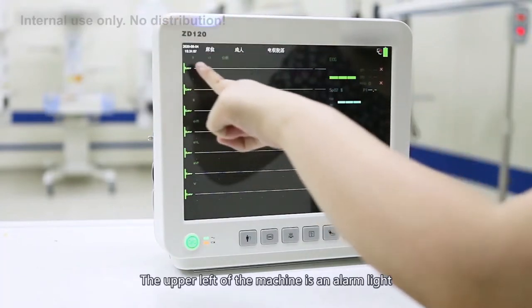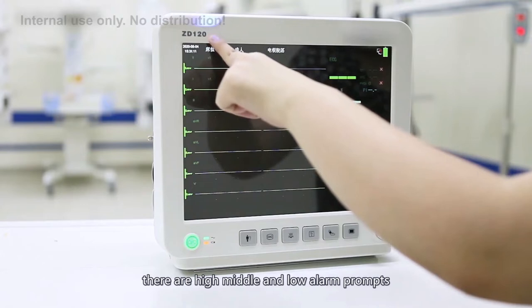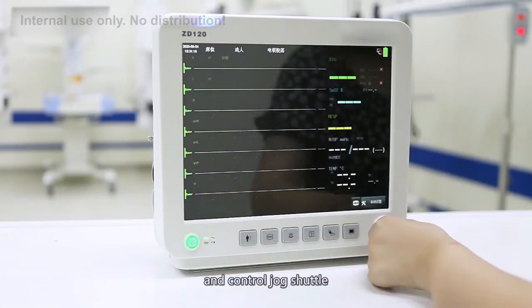The upper left of the machine is an alarm light. According to different alarm levels, there are high, medium, and low alarm prompts. Below is the switch key, shortcut keys, and control shuttle.